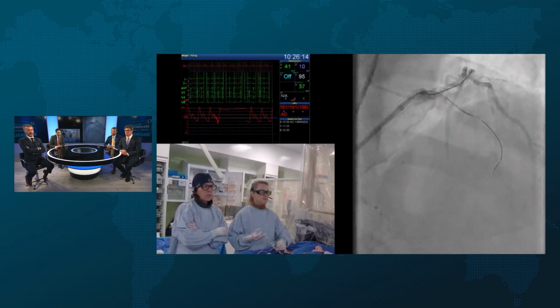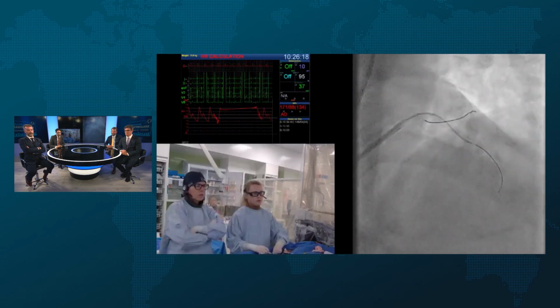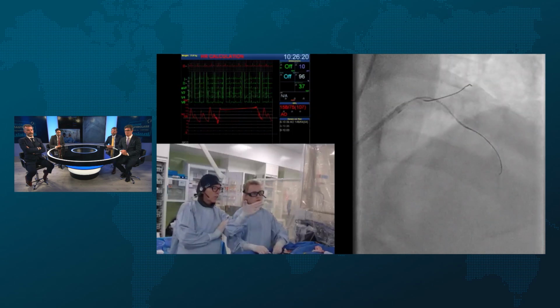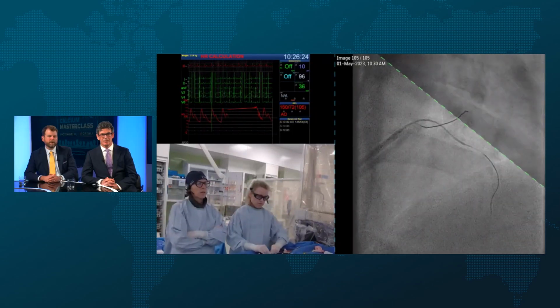See, there's a branch off that bend that wraps round. There's no filling. You know, the other thing, to the right of the calcium, come back. You have a huge septal in that aneurysm.